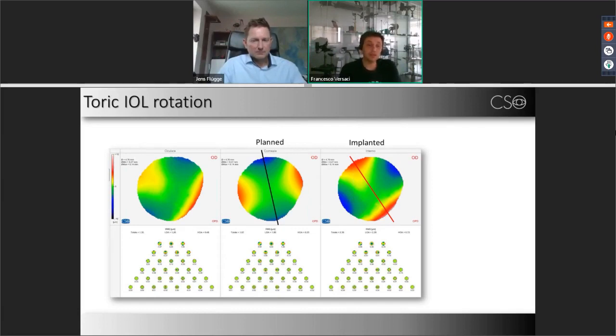So this one is a display of the ocular, the corneal, and the internal wavefront, and you can easily see that the internal wavefront is exactly showing the astigmatism of the lens. So in this case, the internal aberration is nothing but the implanted lens, because there's nothing else into the eye.